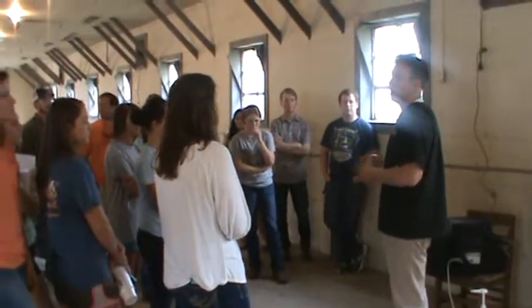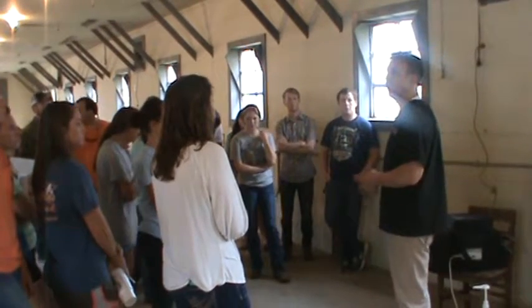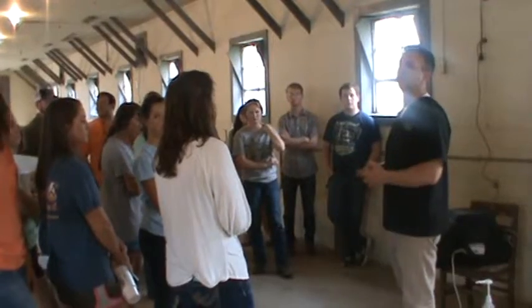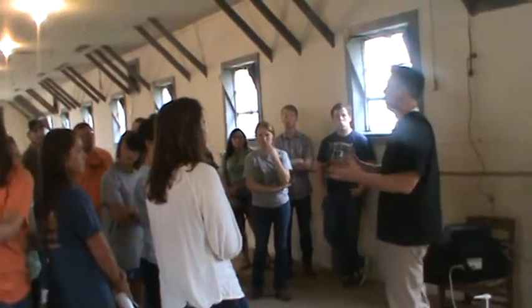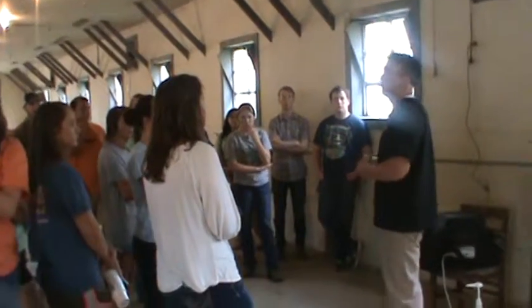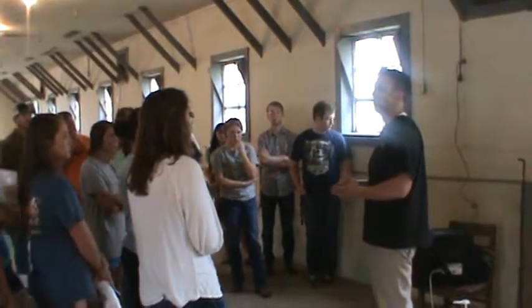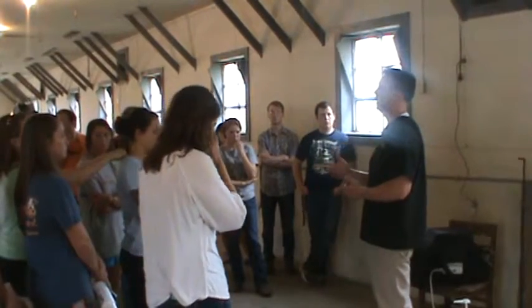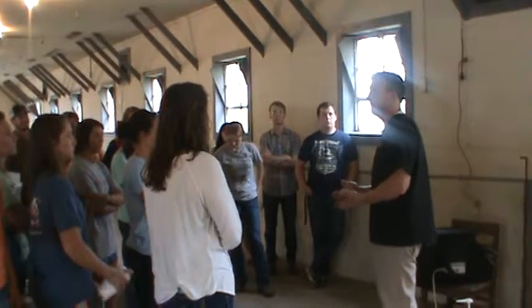So doing the breeding soundness evaluation has told us, hey, there's something kind of weird and funky. How old is this mare? I'm not sure, but up there. Oh, she's, okay. So 18. Probably that is just an old age change that typically happens in mares that have been open for many, many years. We don't think that this mare's had a baby, right? So she's probably got some scarring in that uterus. It's just a fact that she's an old lady, okay?